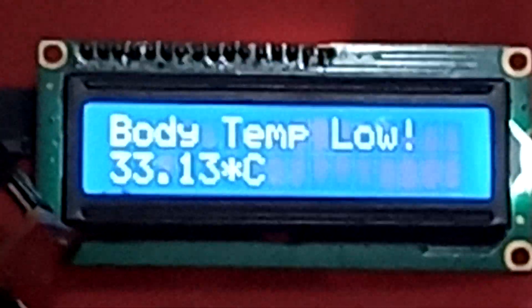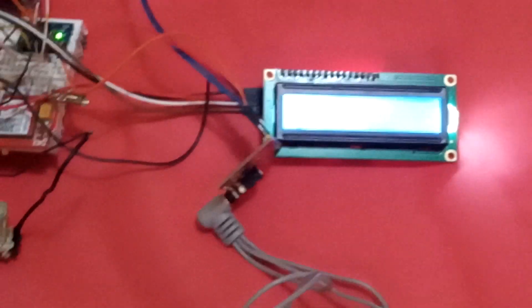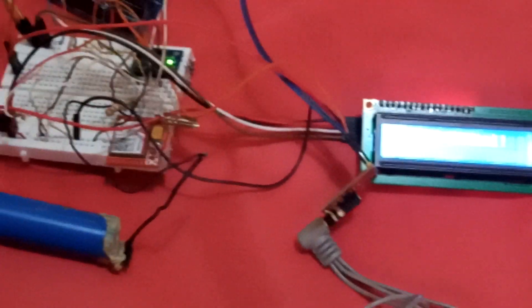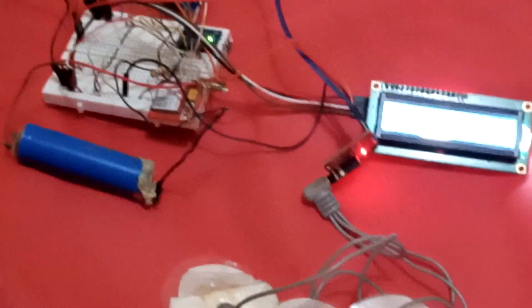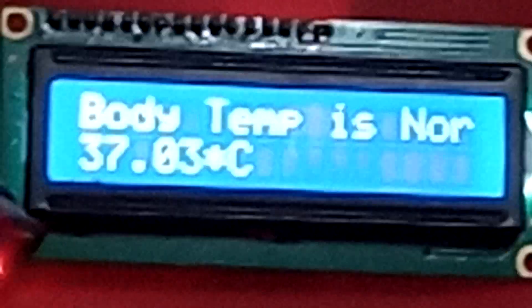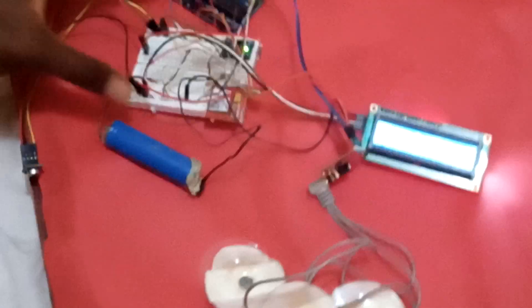Okay, body temperature is low now. We get the normal temperature. Now body temperature is normal — it falls within the range. So this is the project.